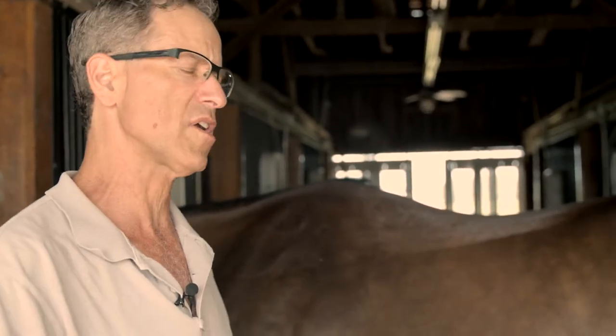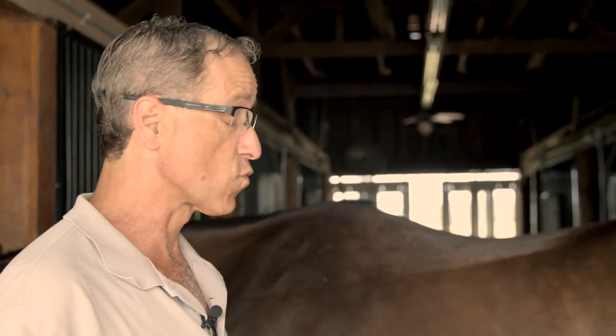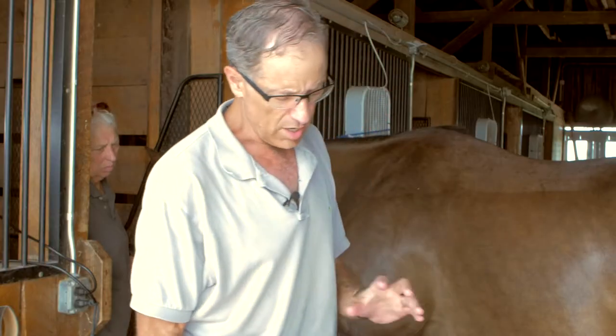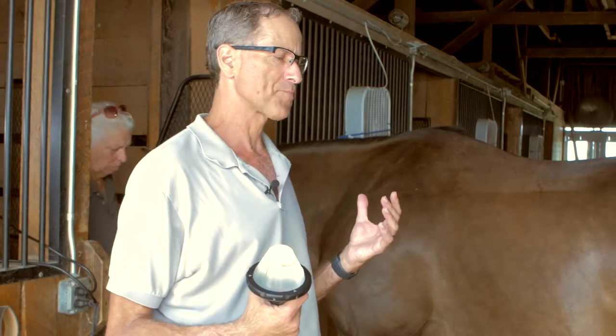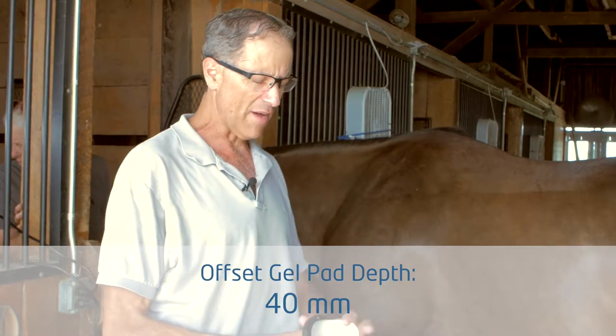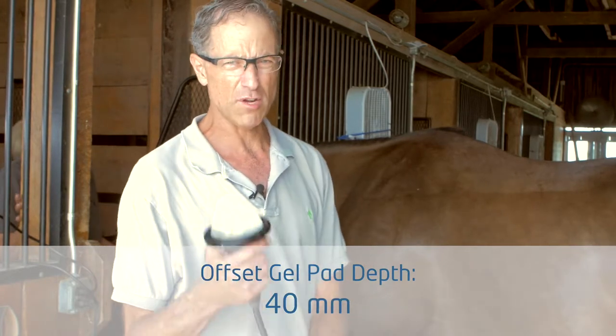I'm not talking about limping lame injuries — I'm talking about soreness, shortness of stride. It's an area that becomes sensitive, and it's really amenable to management using this type of therapy. The anatomical depth we're looking for is approximately an inch and a half, so I'm going to go with a 40 millimeter offset probe for demonstration purposes.